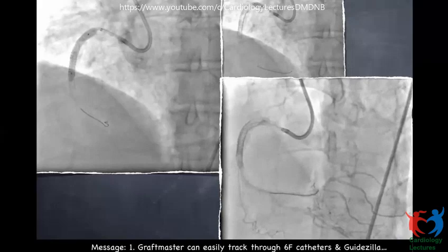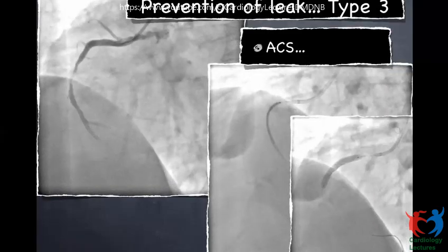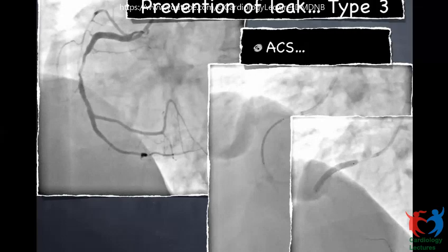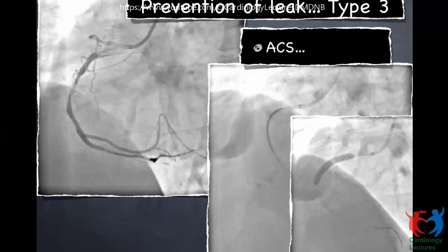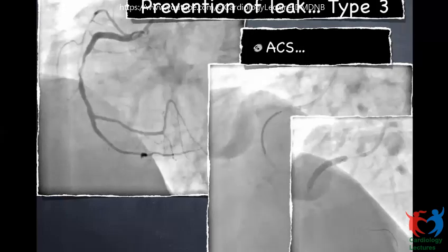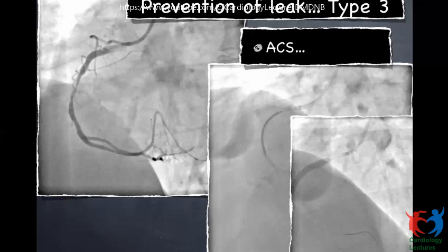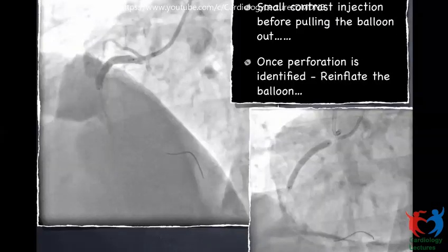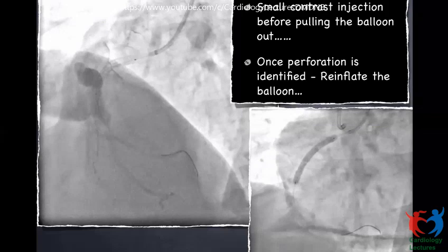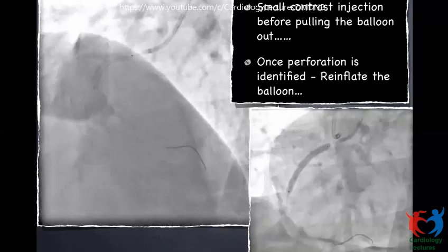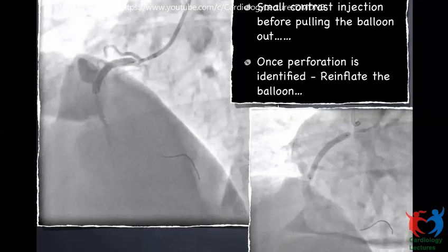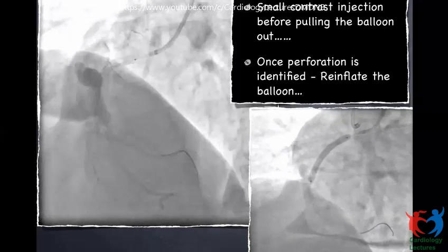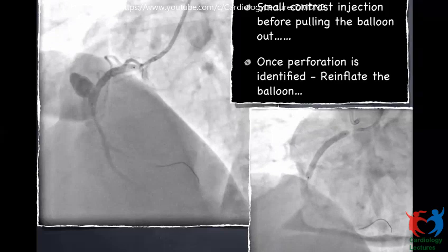This next patient had an acute coronary syndrome with a tight lesion in the proximal right coronary artery. We deployed a 4 mm stent directly. Following deployment, there was a Type 3 perforation — free flow into the pericardium. Before pulling the balloon out, we made a short injection and identified the perforation. The next step was to immediately dilate the balloon and partly reverse the heparin effect.